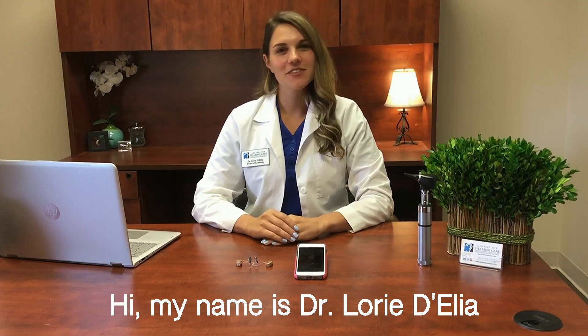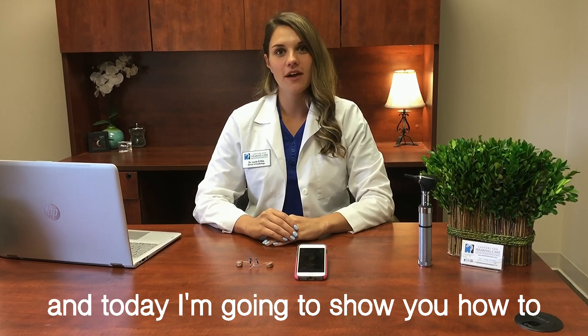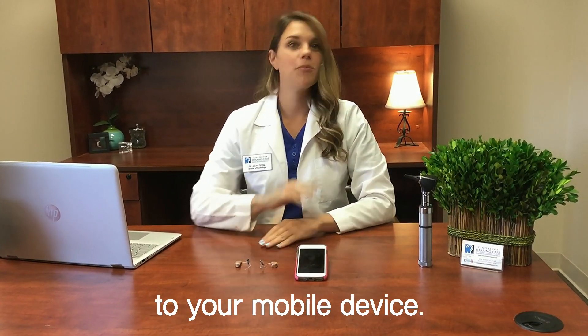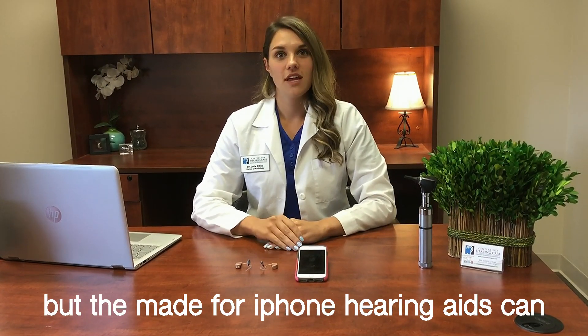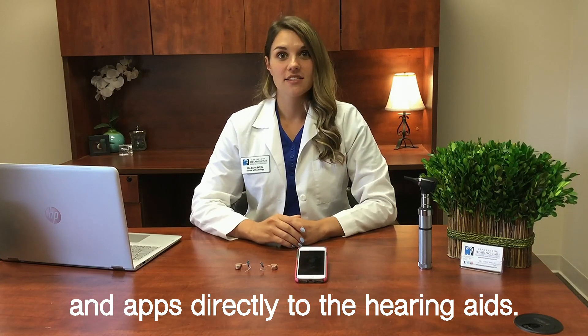Hi, my name is Dr. Lori Delia with the Centers for Hearing Care, and today I'm going to show you how to connect your made-for-iPhone hearing aids to your mobile device. Not every hearing aid has this capability, but the made-for-iPhone hearing aids can stream your phone calls, your music, and apps directly to the hearing aids.